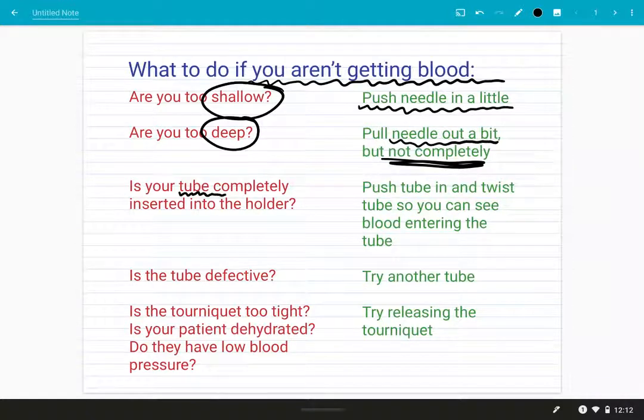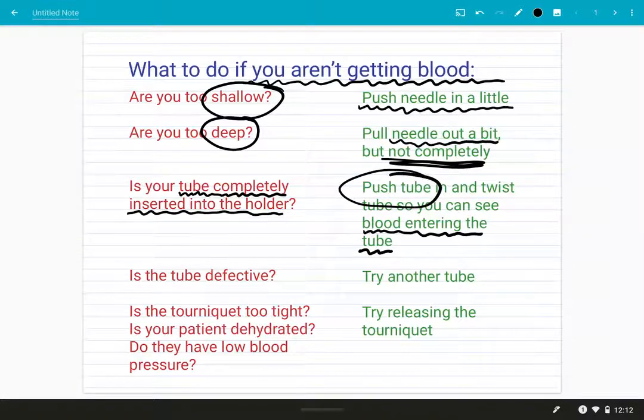Sometimes the tube is not completely inserted into the holder. I find that if you just twist the tube a little bit, that can help break the seal and it can also help you view the blood entering the tube if the label is blocking your vision. Definitely make sure that you're pushing your tube all the way into that holder. Sometimes the tube is defective — there's something wrong with the vacuum seal.